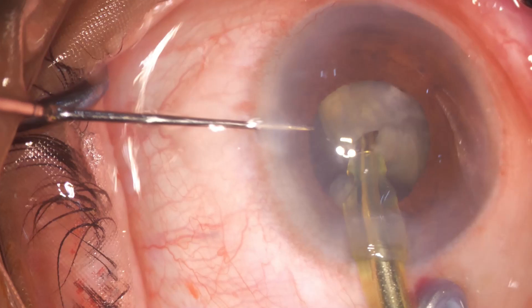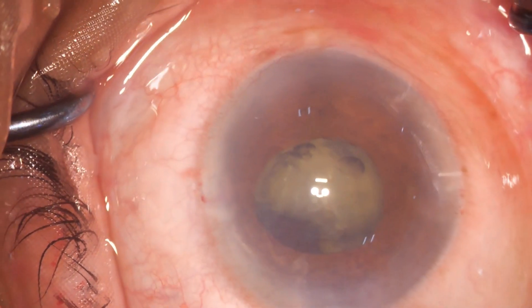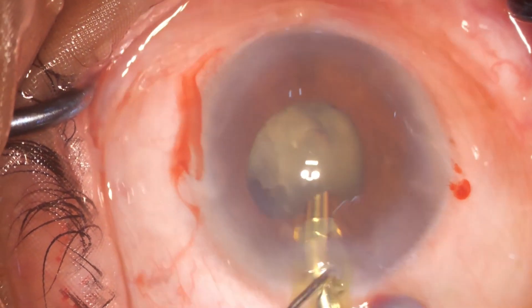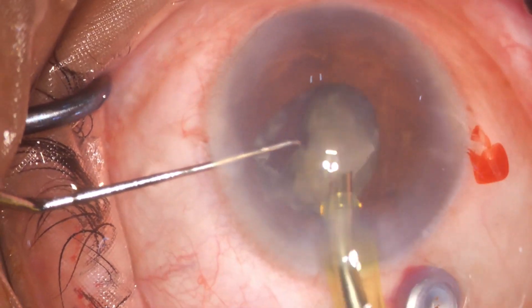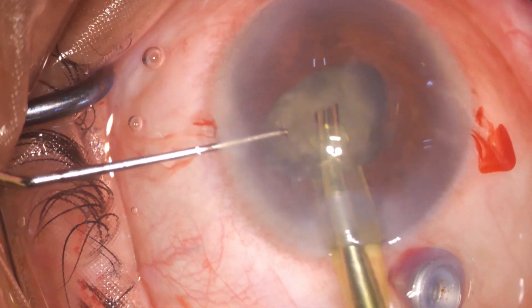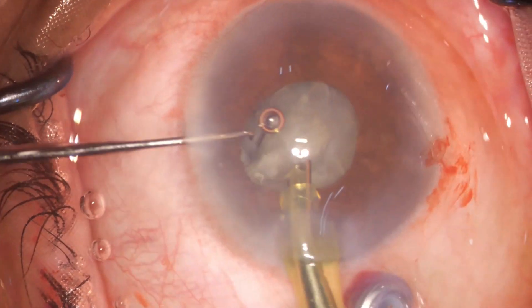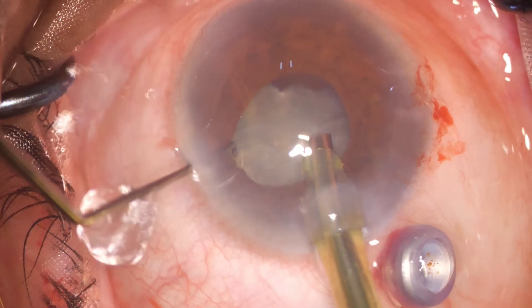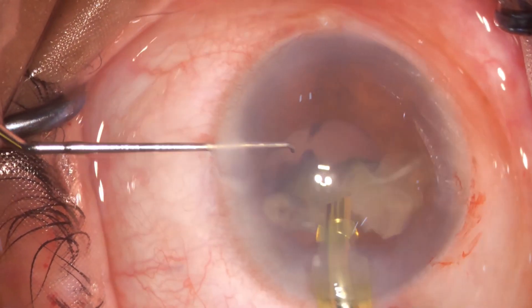Your judgment is different compared to regular cases. Keep injecting viscoelastic to prevent any striate keratitis on day 2. The pupil is also very small, and therefore even the rhexis created with the femto is not as large as it would be in a normal eye.